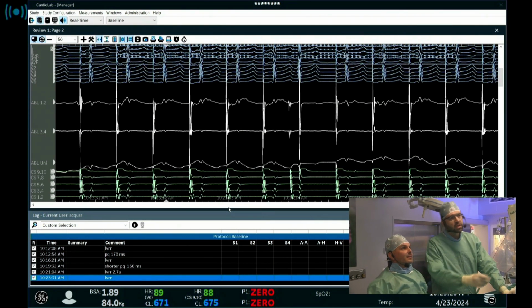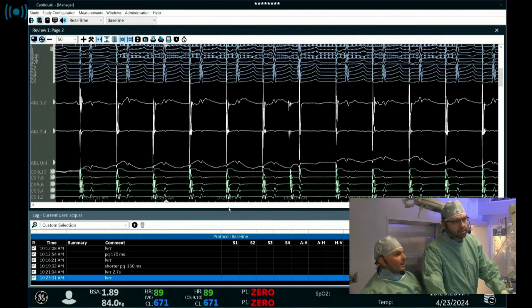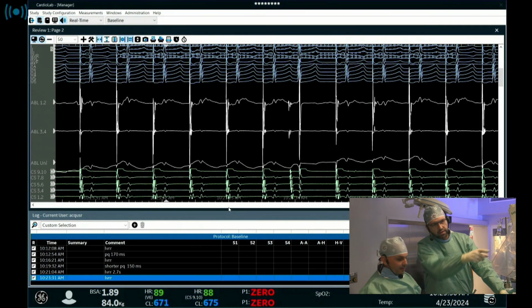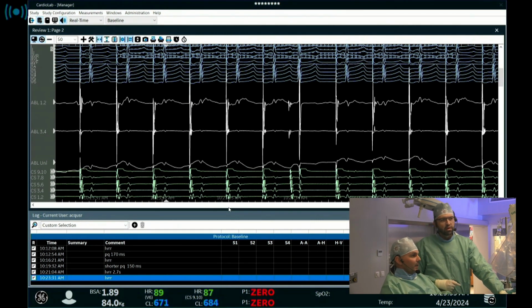But when I followed, you did ablation mostly in the coronary ostium? You also did it in the pyramidal space from the right atrium. Maybe put the catheter just to see where it was. So Roman, this would be your endpoint for this lady?